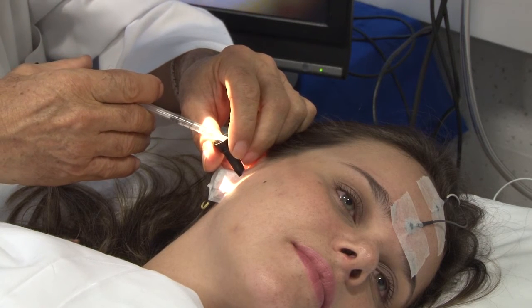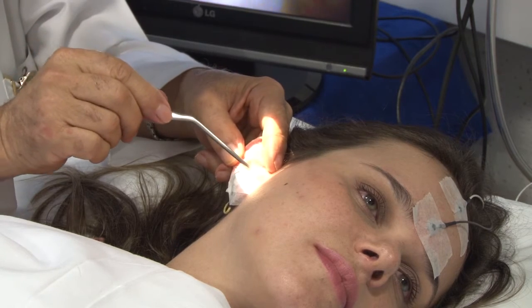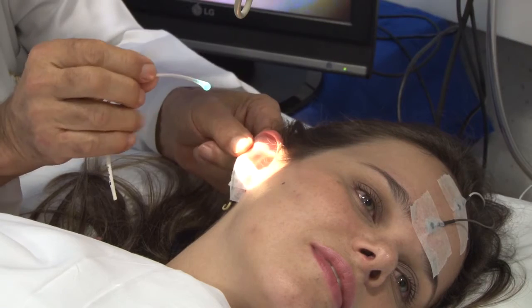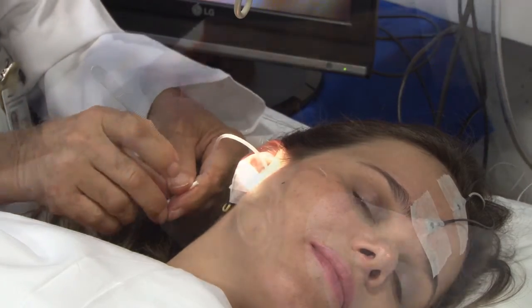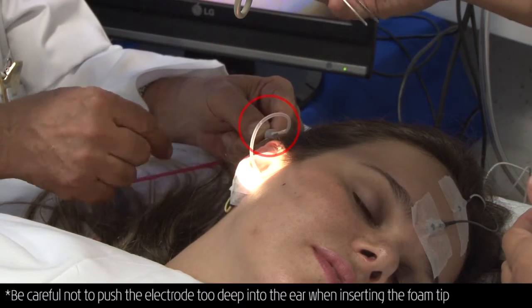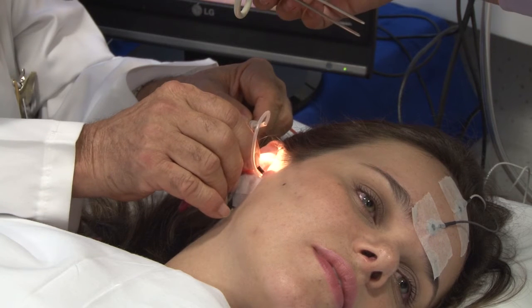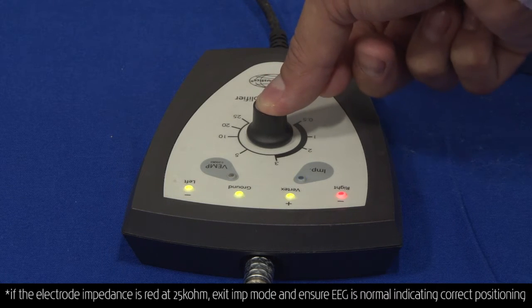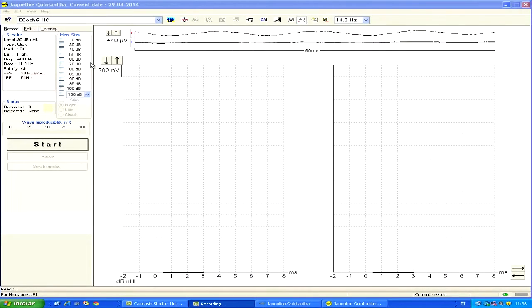Now Dr. Almeida will put 1 ml of warm saline solution into the ear canal. After a minute, he is now removing all liquids from the ear canal. The ear canal and the tympanic membrane should be absolutely dry and clean to receive the TM electrode. The TM electrode with electro-gel on the tip is carefully positioned on the tympanic membrane, posterior-inferiorly. Be sure not to place the electrode on the malleus manubrium. Dr. Almeida will connect the electrode to the cable and fix it with the insert earphone. The insert earphone will help to fix the TM electrode on the tympanic membrane. Now it is time to test impedance — for the TM electrode, an impedance of 20 kOhm is usually acceptable.